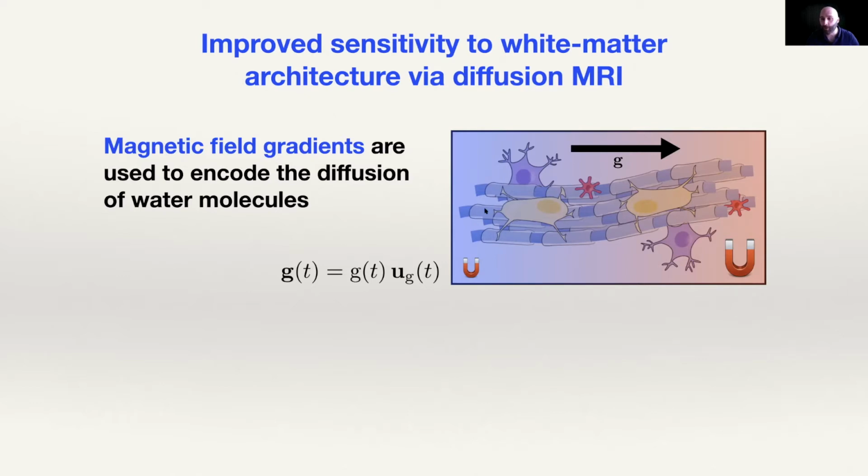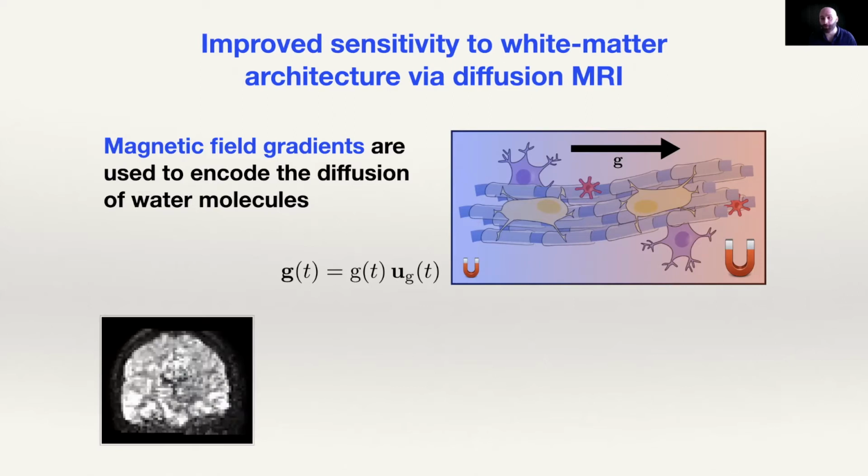And then you can say, oh, my water has been diffusing during my acquisition. It has been changing magnetic field locally, and then it's not fully coherent with itself and it loses coherence. So you have a signal decay. It gives an image that looks like crap, honestly, compared to a T1 image, because it has other limitations on the hardware that make it a bigger, coarser resolution. So it's not as pretty.